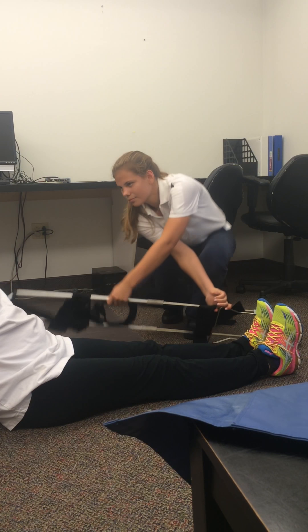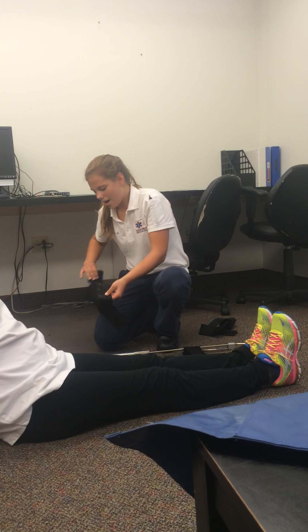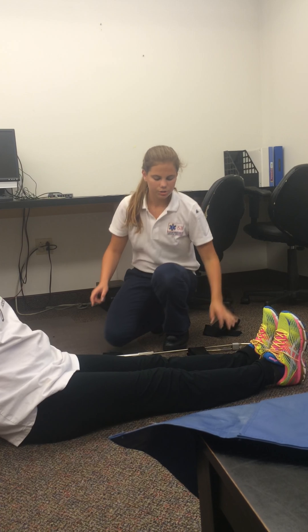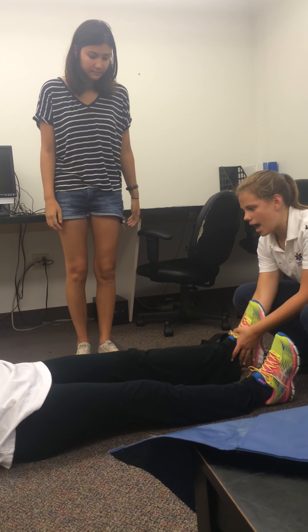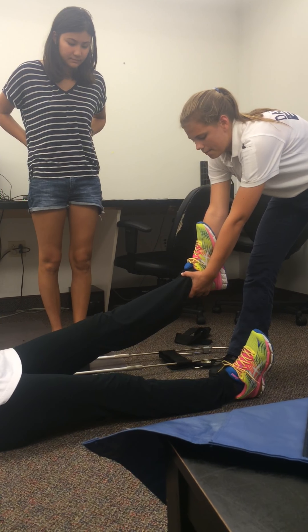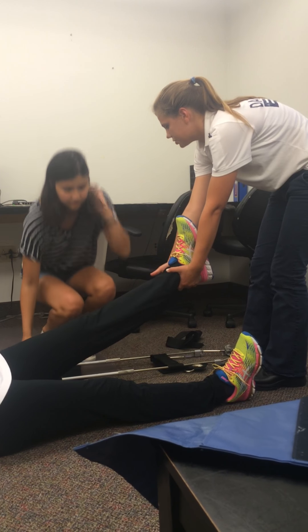Normally patients don't cooperate like this — they'll be in so much pain. You need a partner for this. One person is going to apply manual traction: grab the ankle, hold it up, and pull. This slightly realigns the bones — there may still be screaming and pain, but it applies traction to try to realign things. Then your partner is going to slide the device under the leg.